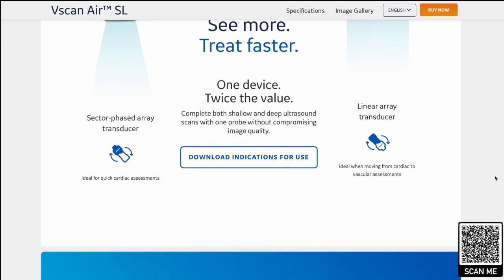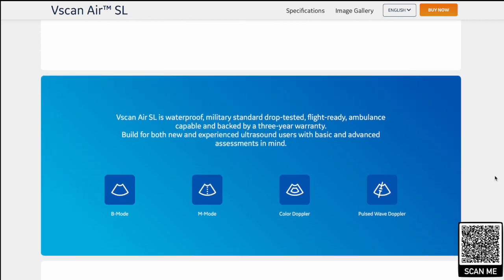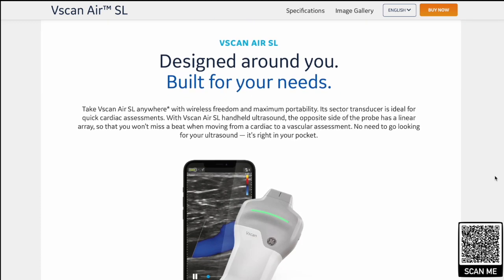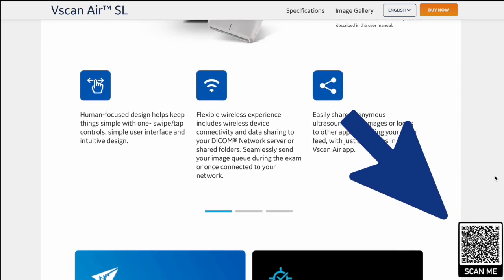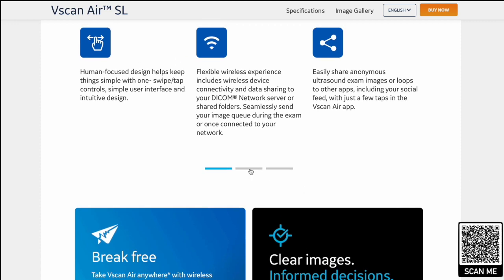This probe has a sector phased array on one end and a linear on the other. What they've done is change it from the curvilinear to the linear that they had in the previous version, which we loved. Scrolling through the website — please do scan the QR code at the bottom to take you directly to it — you can see what the probe is all about according to GE.